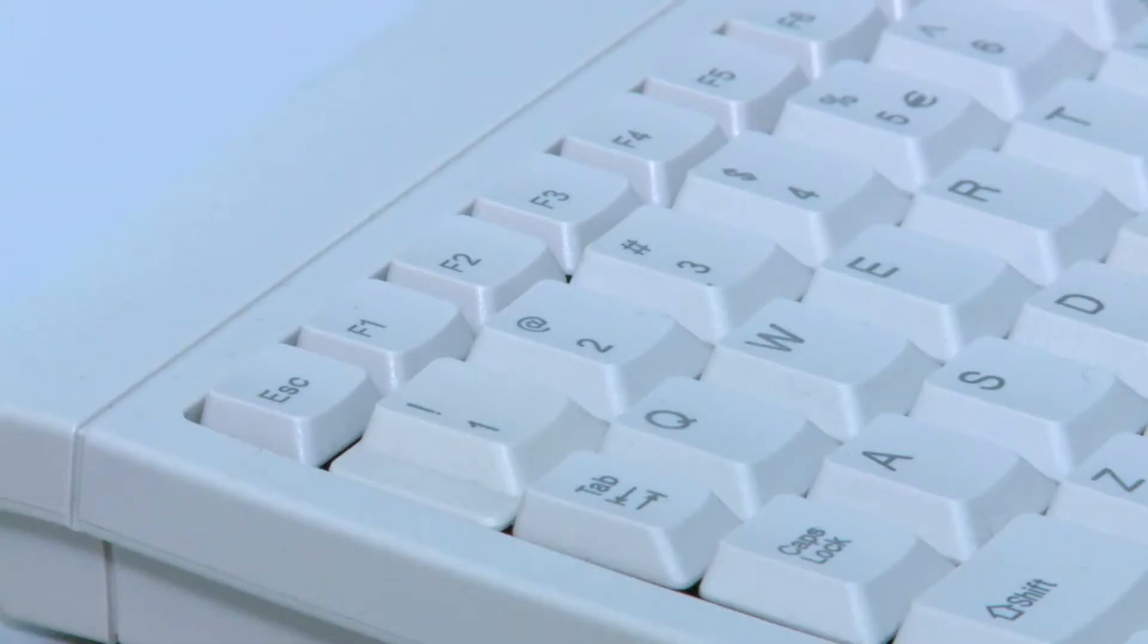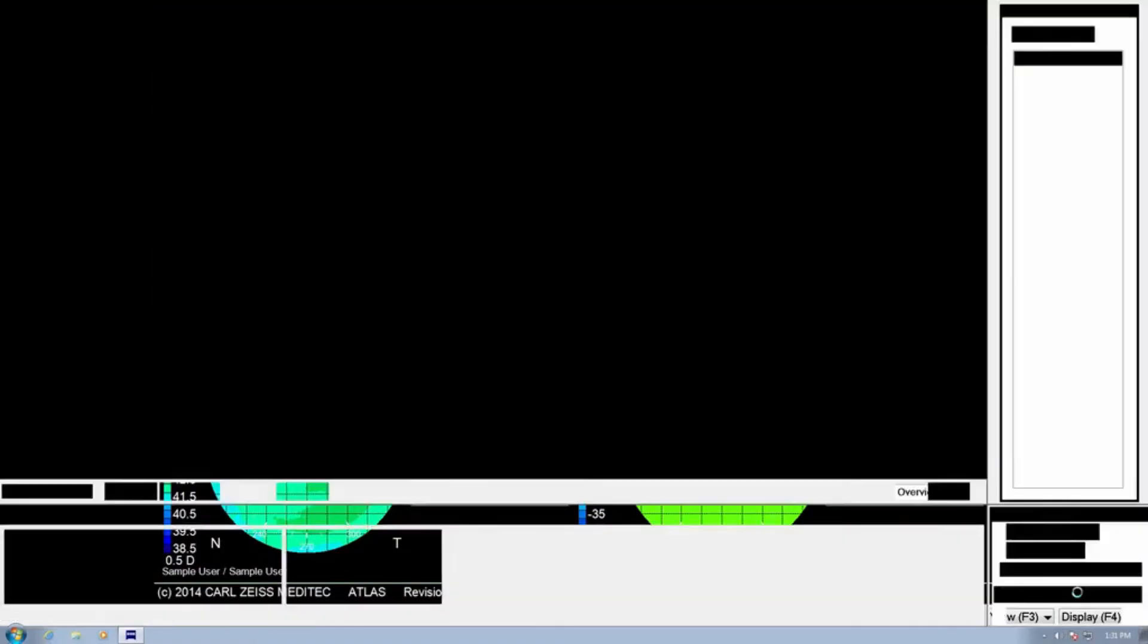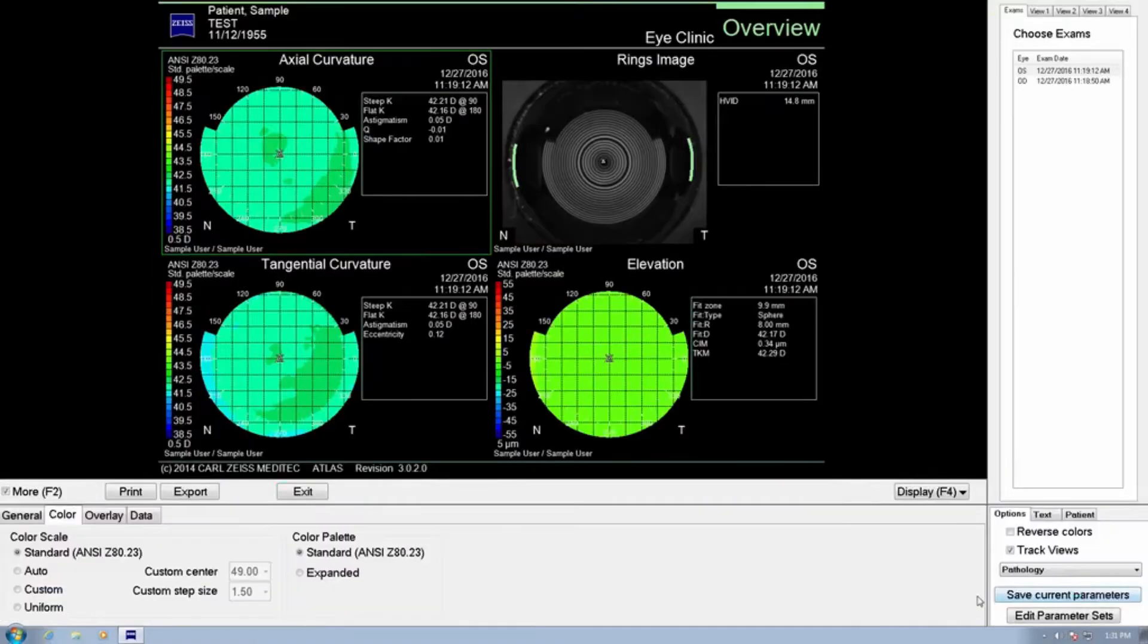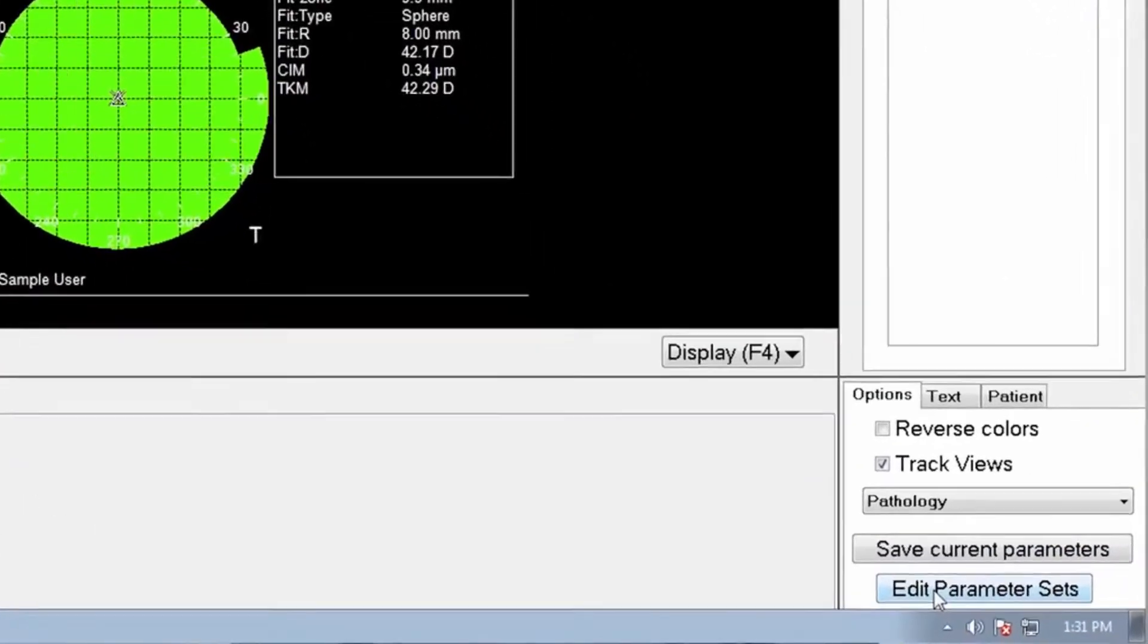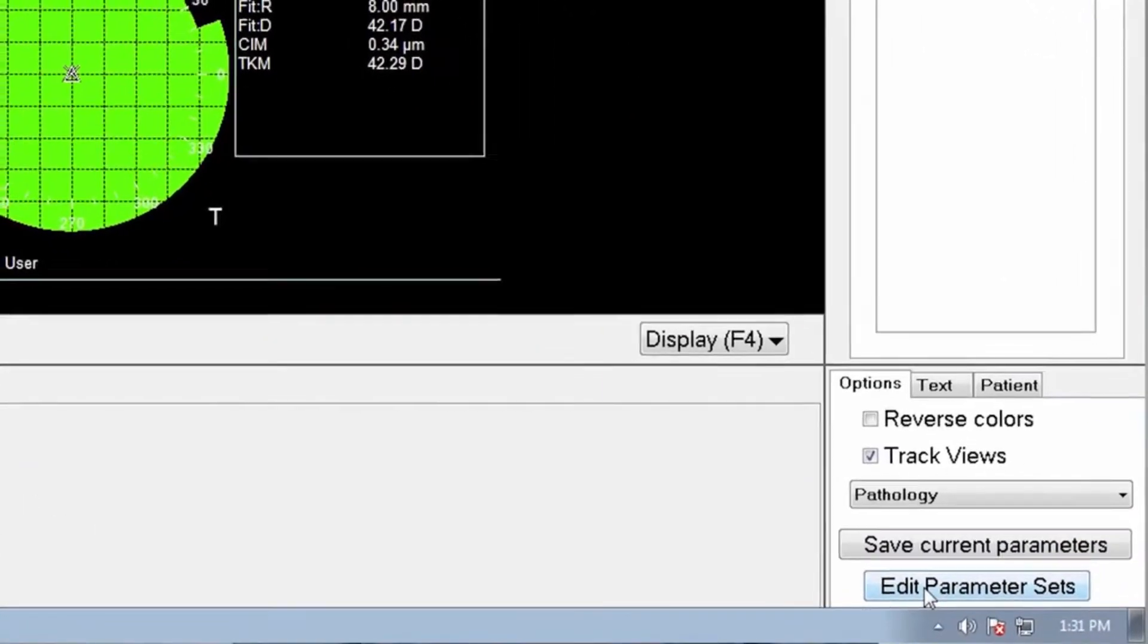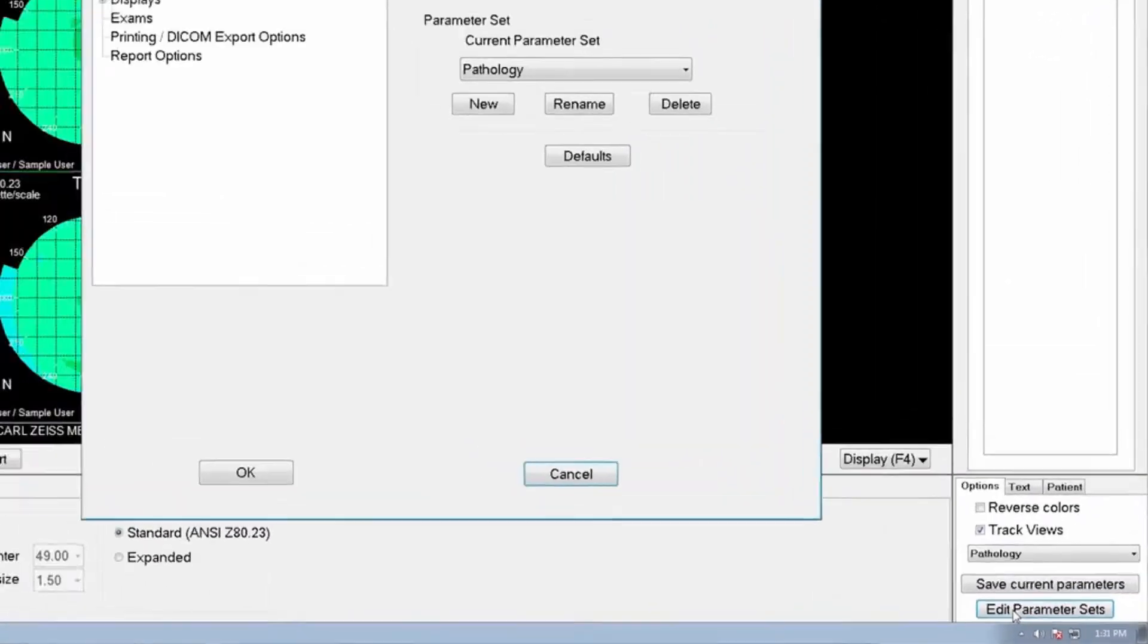Press the F2 button on your keyboard. This will expand your window to view the customization menu. Select Edit Parameter Set to reveal the Parameter Set screen.